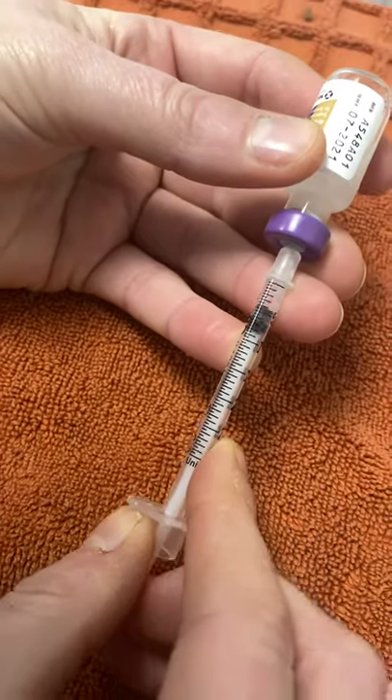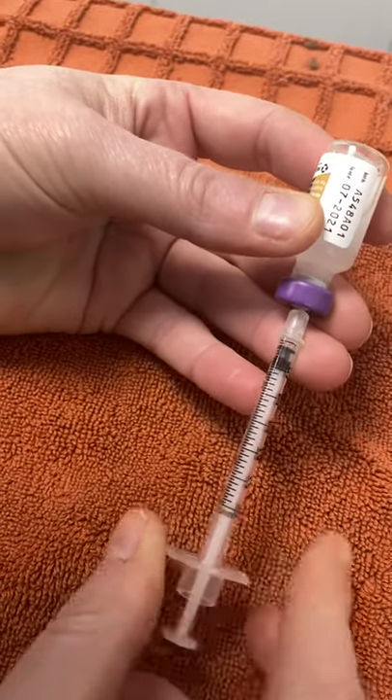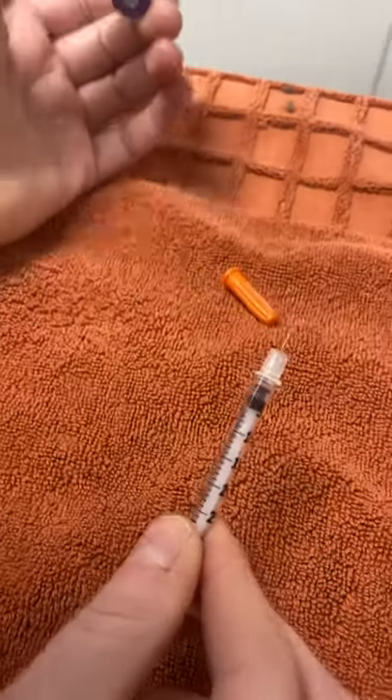We want to make sure that there are no bubbles in there — get rid of those. Make sure that we leave it at the correct volume, and then that is it.